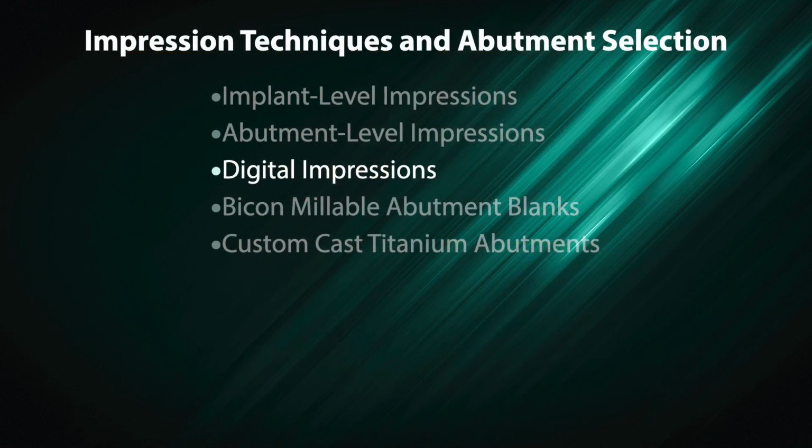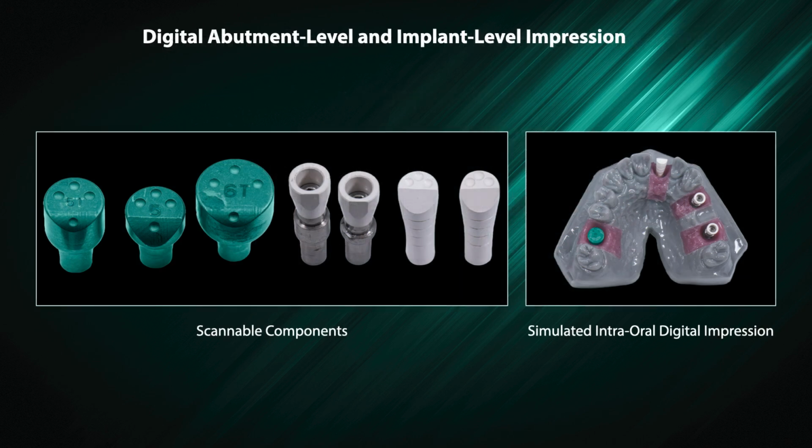Digital impressions. Digital abutment level and implant level impression. On the left are scannable components, and on the right is a simulated intraoral digital impression.